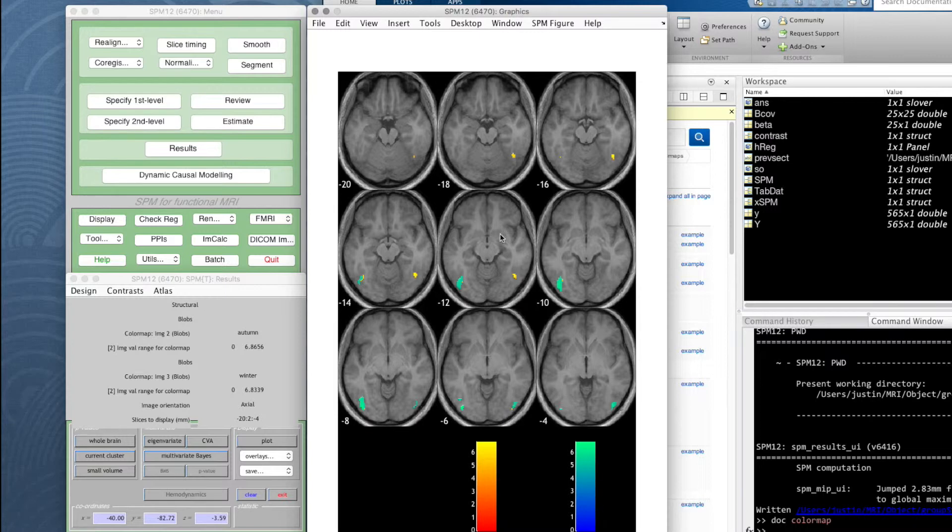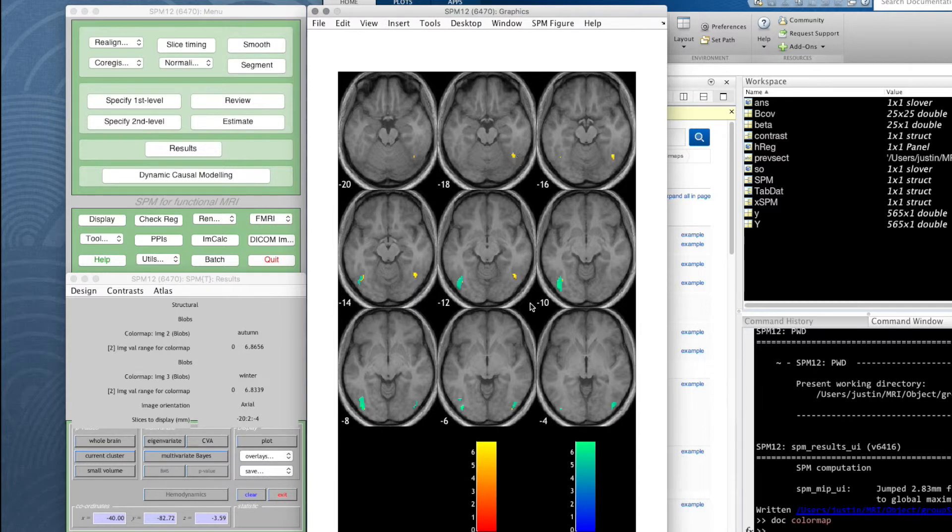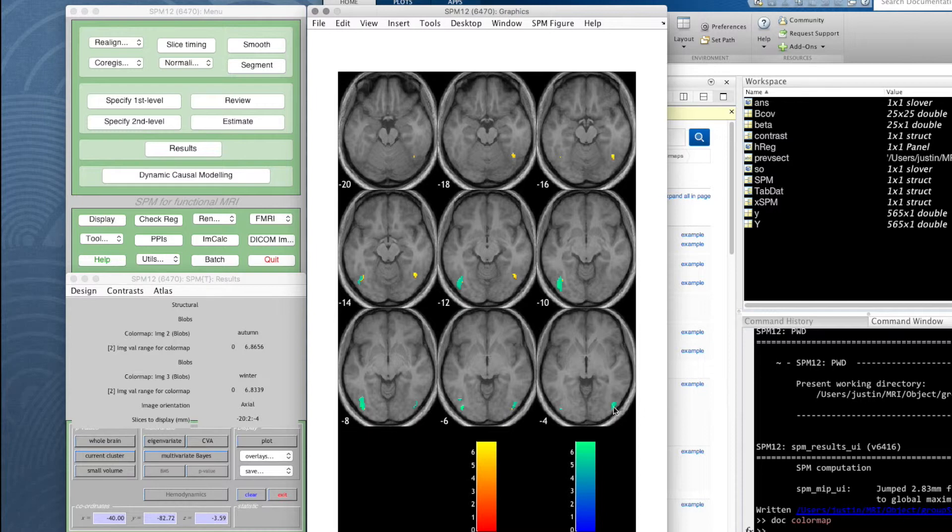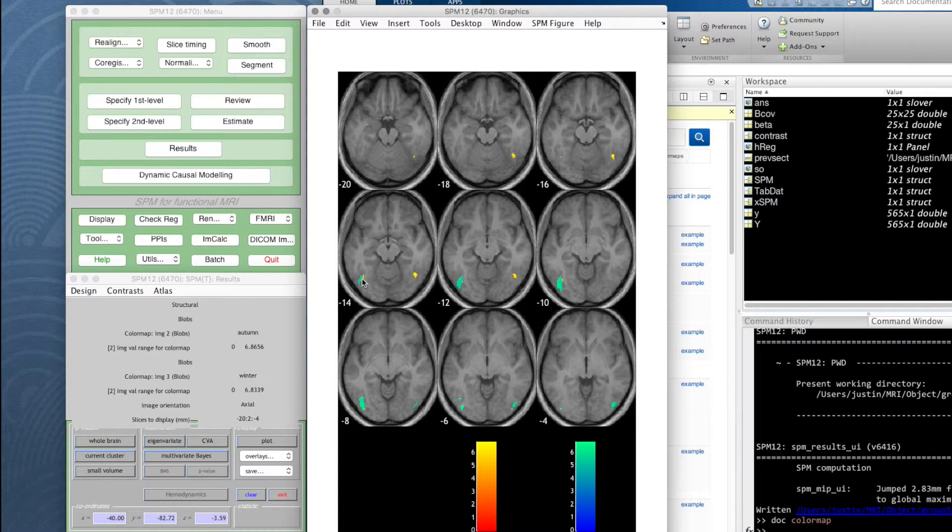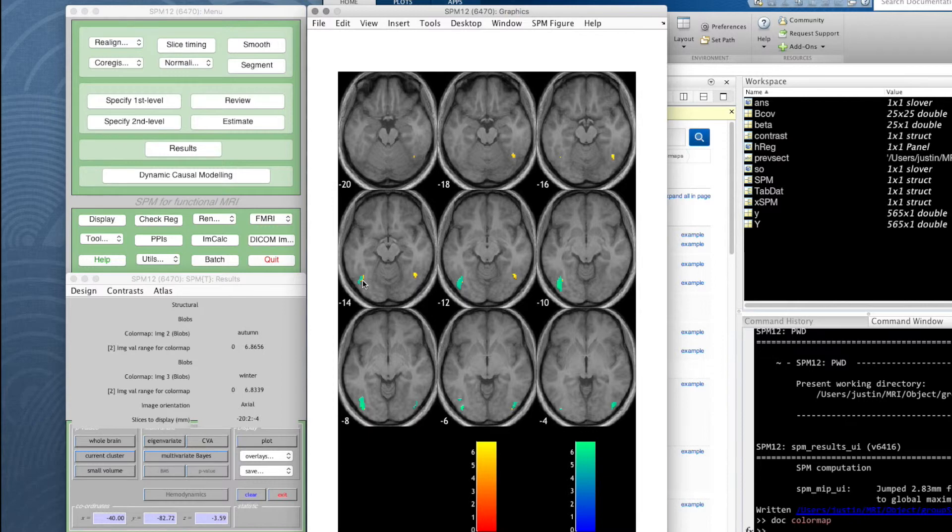So we can see on the right hemisphere we've got the face locus or focus, and that seems to be separate from the slightly higher object focus. Whereas on our left hemisphere it's possible we've actually got some overlap, which may not be genuine overlap. It may be that one participant's object overlaps with another participant's faces, and because the normalization is only approximate, puts everyone's brains in the same shape.